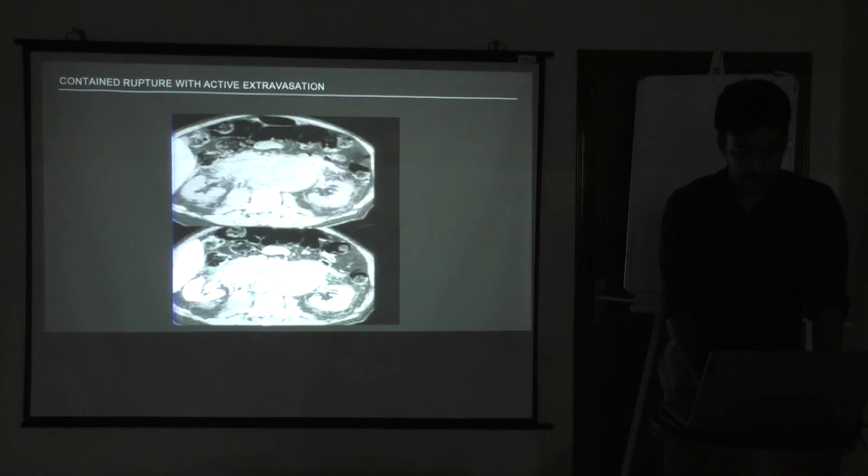So the importance of this slide is, when you give... I know CT scan is not an ideal investigation to identify the location. CT angio helps in case of aortic aneurysms, even to do some intervention also.